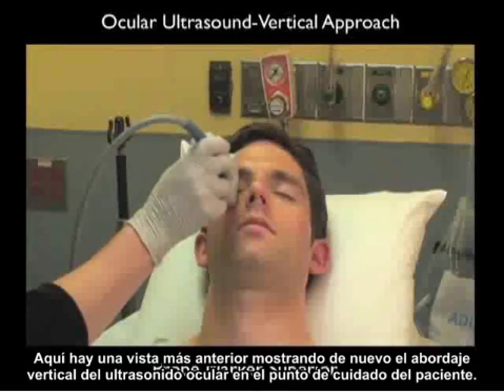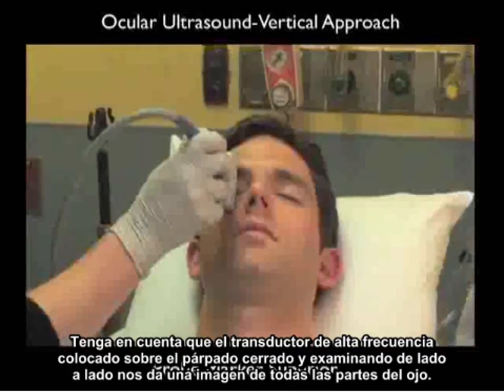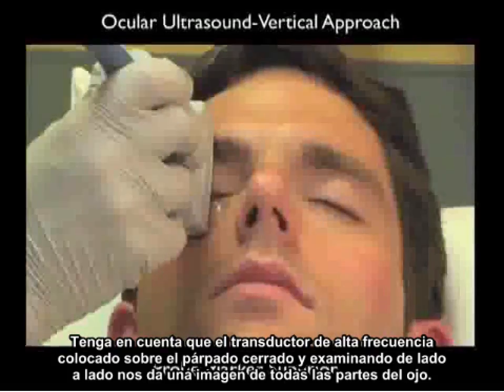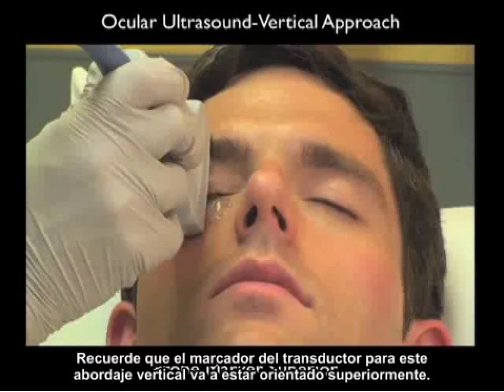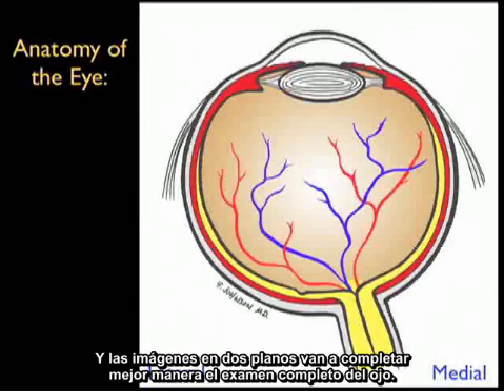Here's a more anterior view, again showing the vertical approach to bedside ocular ultrasound. Note the high-frequency probe placed over the closed eyelid, and scanning from side to side will image all parts of the eye. Remember that the probe marker for this vertical approach is going to be oriented superiorly. And imaging in two planes will best round out the examination of the eyeball.